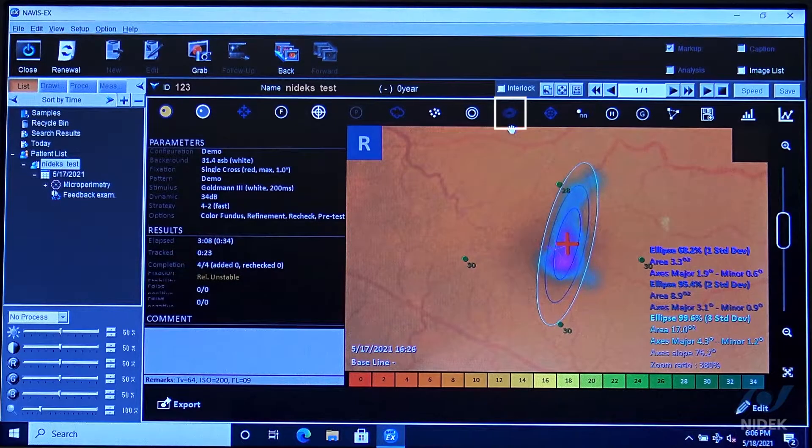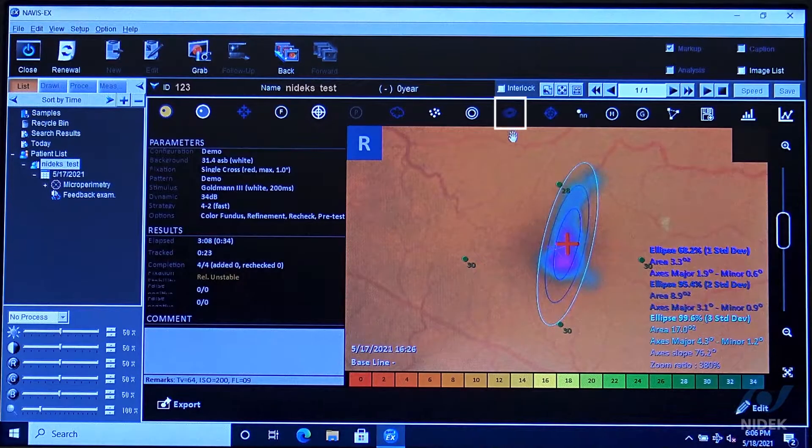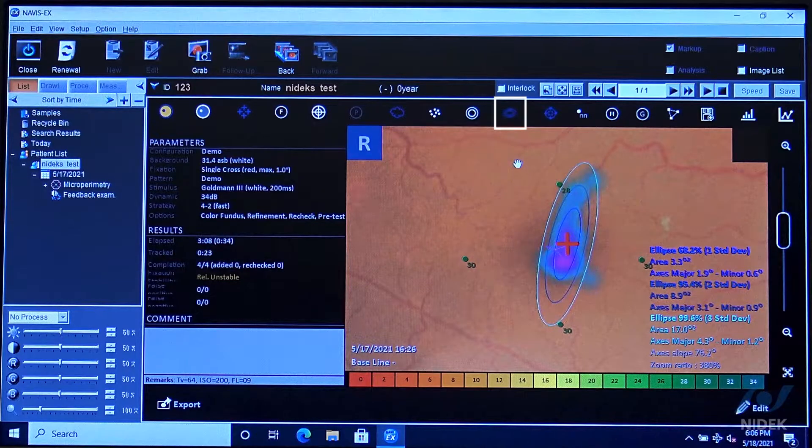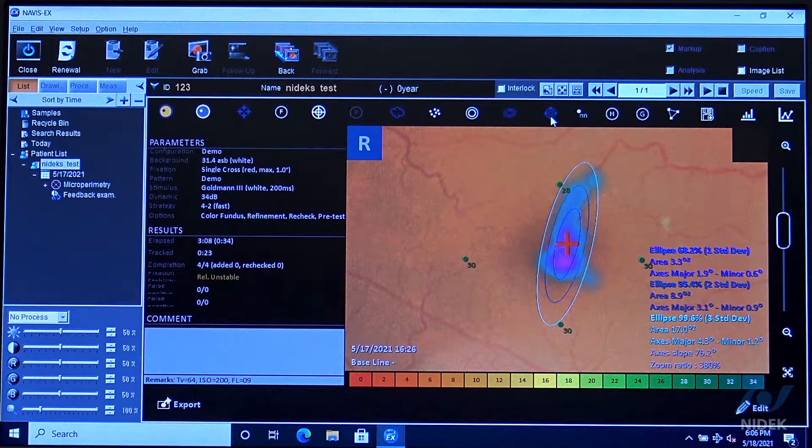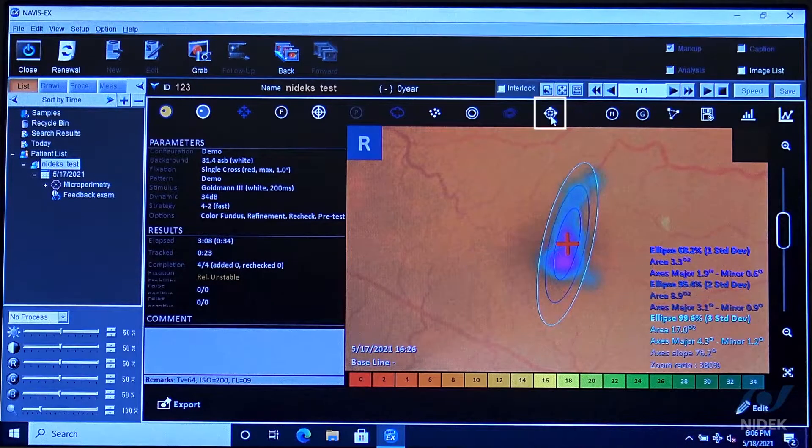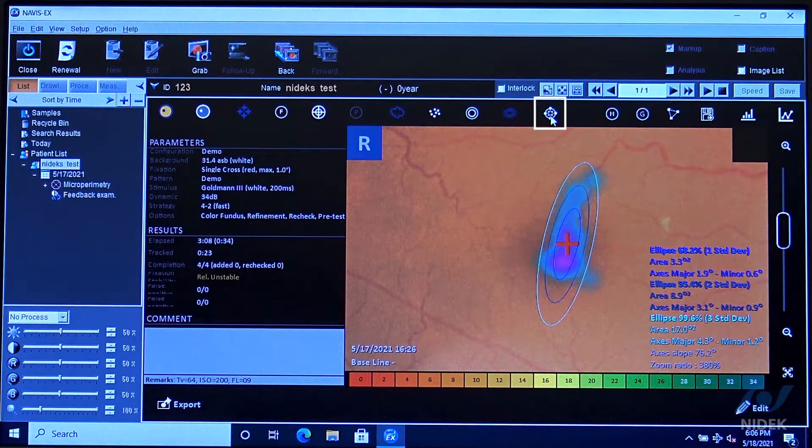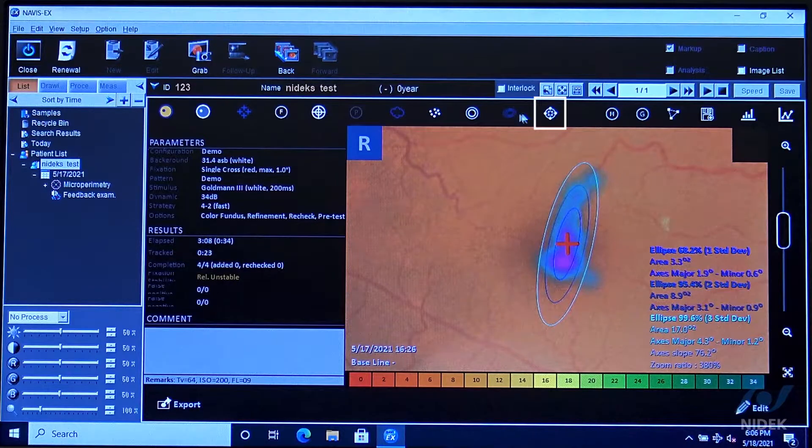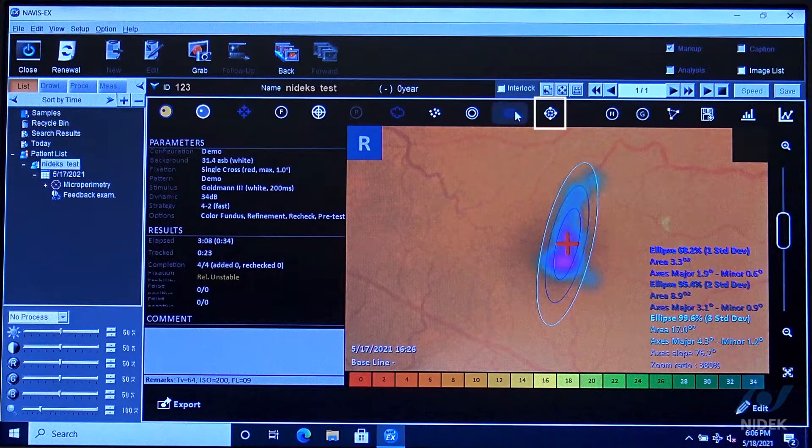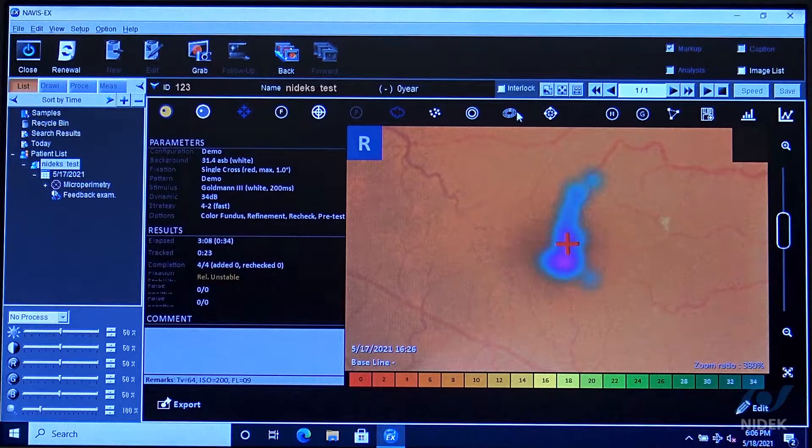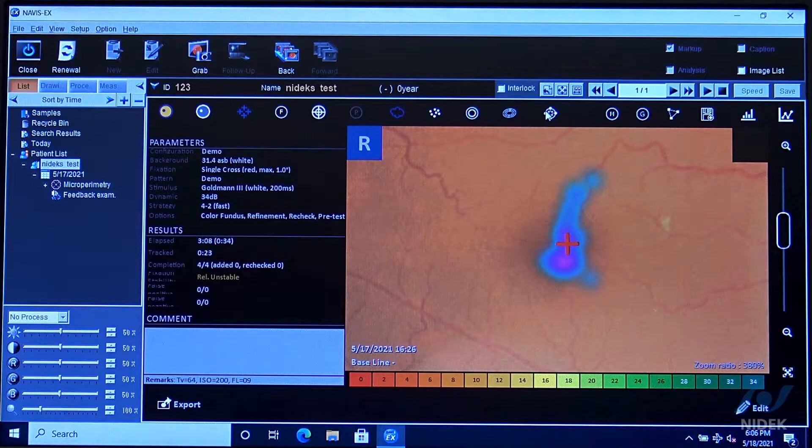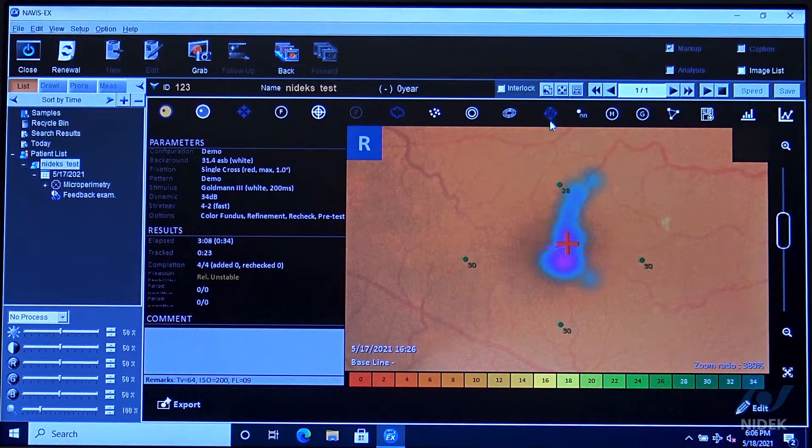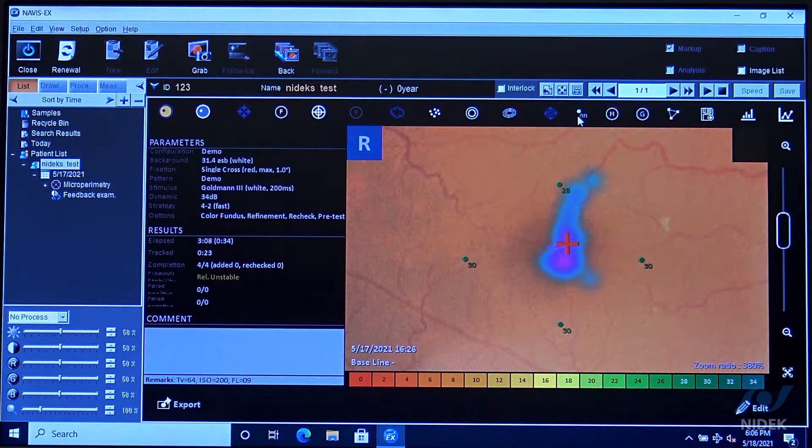This is the bivariate contour ellipse analysis. This is to take off the fixation points. I'm going to remove the BCEA, or we can put the stimuli back on.